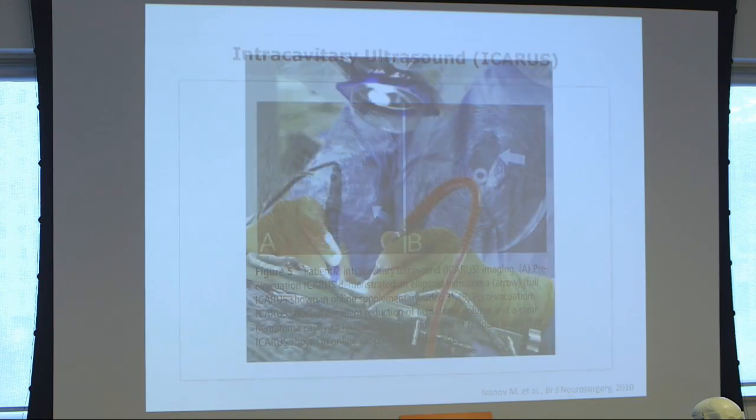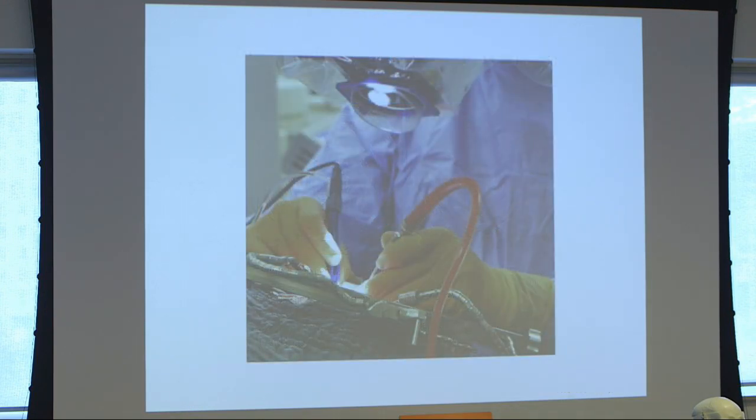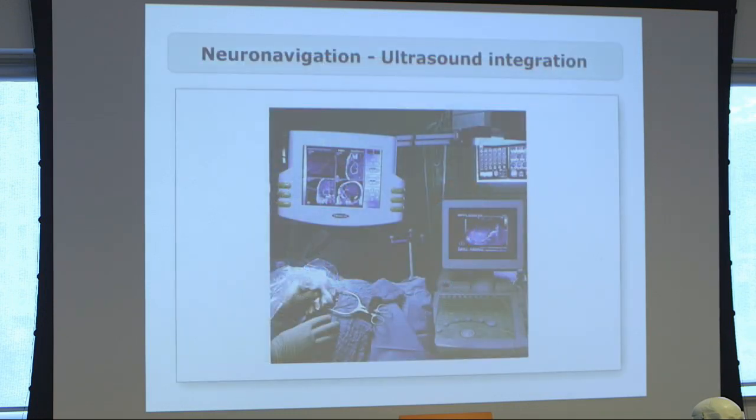You have to integrate ultrasound into your general workflow, and you've got to be very careful where to put your machines. You can integrate the ultrasound image straight into your neuronavigation device, which makes sense because the MR image can virtually then interpret your ultrasound plane that you're working in, and you've got a cross-reference here that makes things a bit more secure.